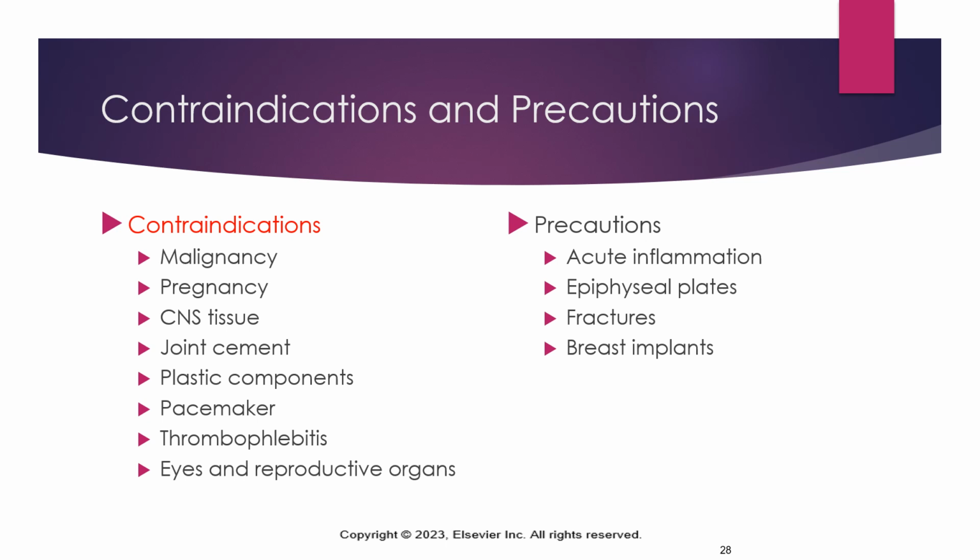And the other thing, the last one here would be breast implants. So staying away from any tissue that's surrounding the breast if somebody has a breast implant. Again, we just don't want to heat up anything internally and cause it to fail.